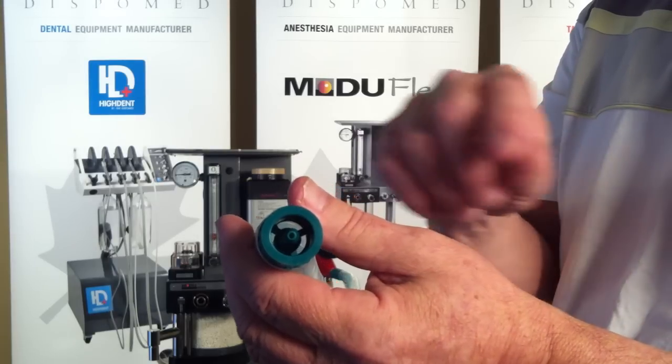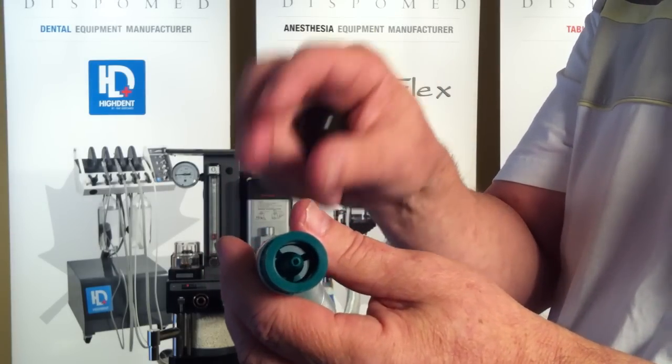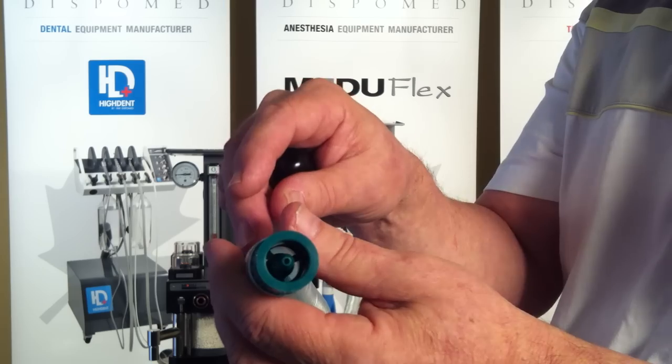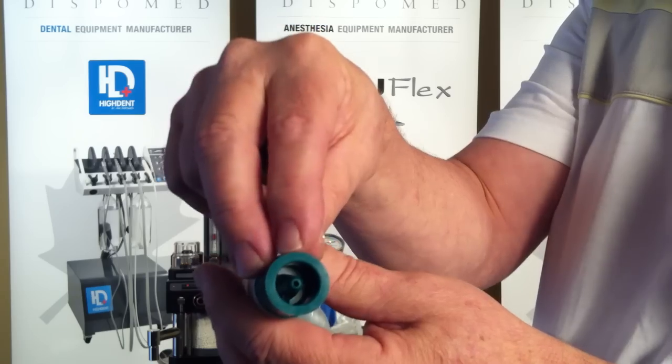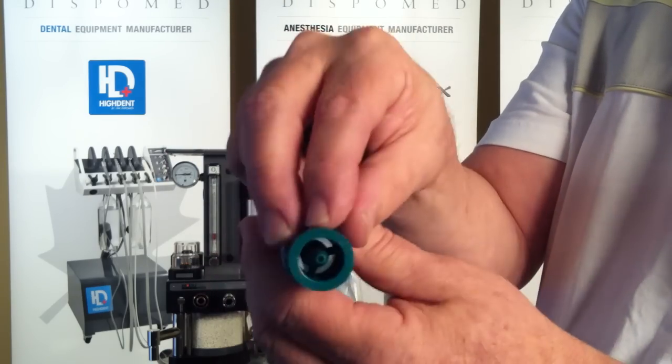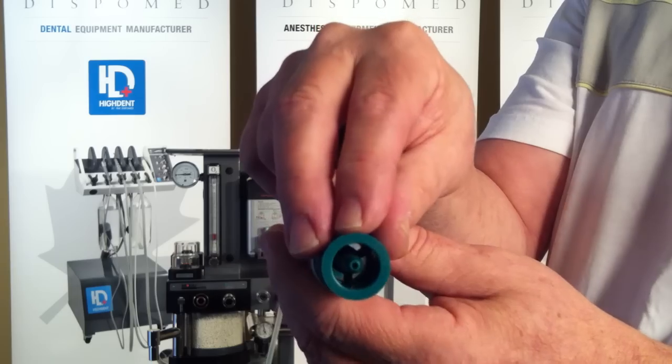One of the advantages of the Bain circuit adapter is that the fresh gas combination of oxygen and anesthetic agent is delivered directly to the patient through the center port on the Bain tube. This is much faster than the CO2 absorber, which causes a dilution effect.